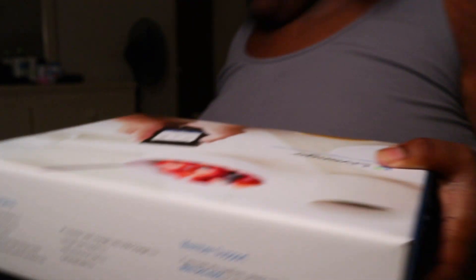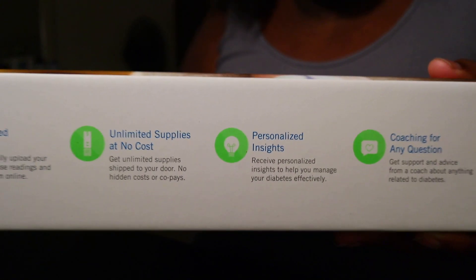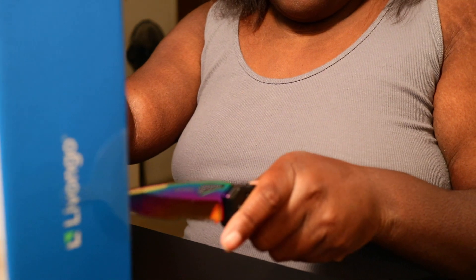Got another box — it just shows you. And then there's nothing really on the back. We're gonna lift this up — oh, I got tape on it. And then there's nothing really on the back.